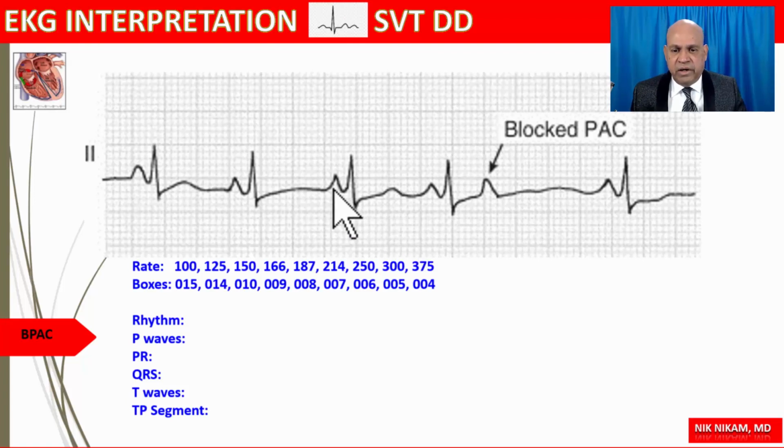Well, first of all, in Mobitz type 2, the PP intervals must be constant. If not, then we are dealing with something different. Here, if you look at the PP interval here and the PP interval here, this is short. That means this is a premature beat. Second, we see a compensatory pause, which is not twice the cycle of a regular sinus rhythm. So this is less than multiples of PP interval. So that is what we can deduct from this.